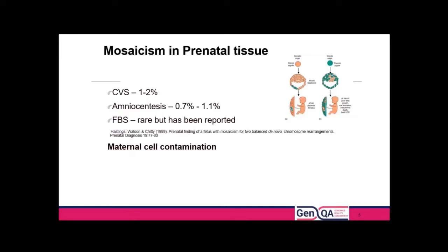A compounding factor can be maternal cell contamination. It's more likely that you would get that in an amnio through maternal blood, because of the way that CVS are cleaned and sorted — or should be — to ensure that there is no maternal decidua associated with the sample.